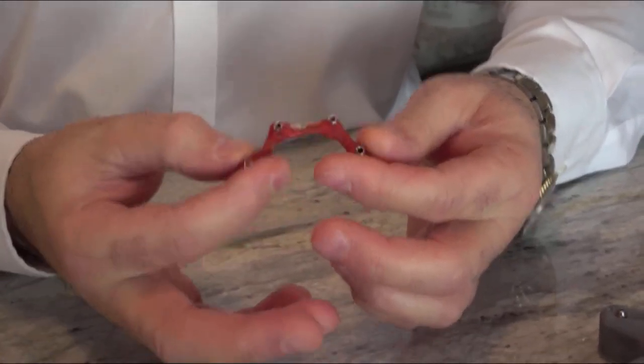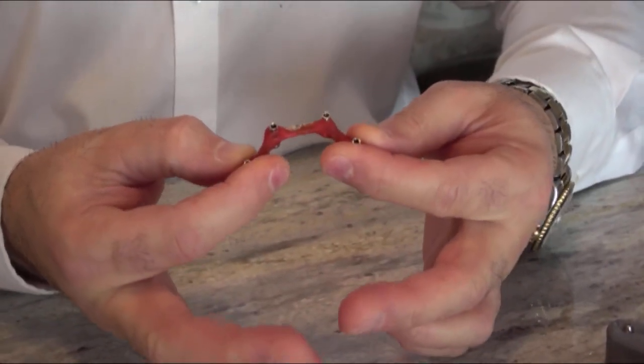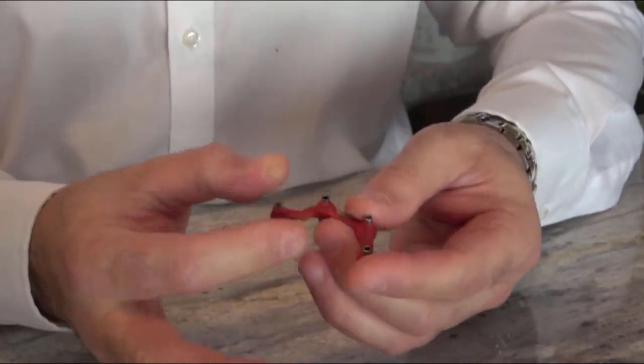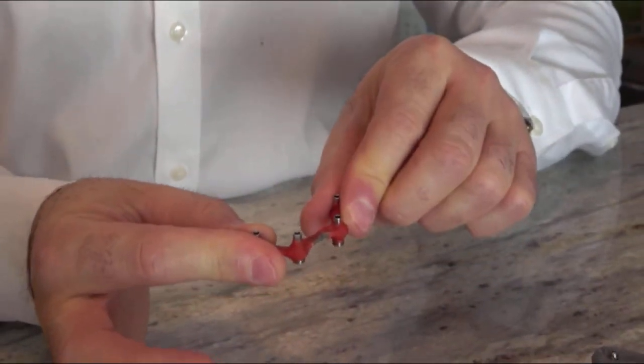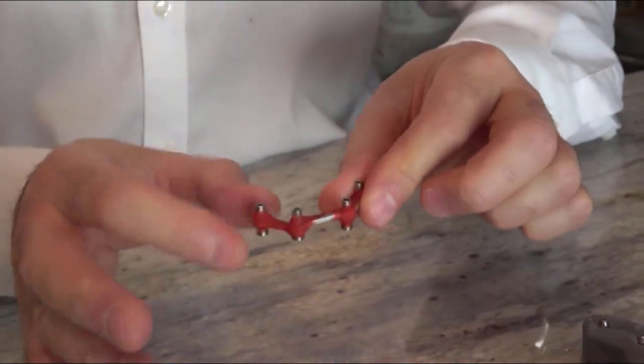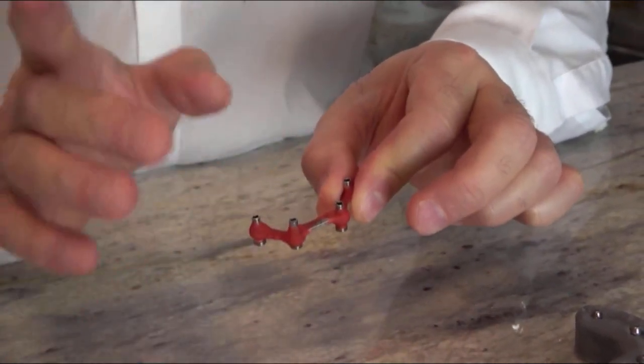See, when I push with my fingers, this is actually solid - that's what you're looking for. Once it sets, it's done right. If something moves, it's a problem and it won't be accurate.